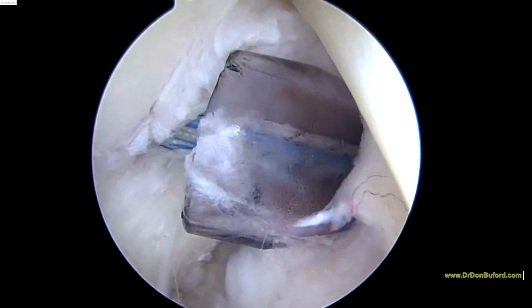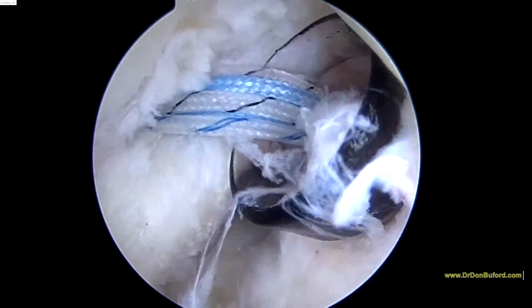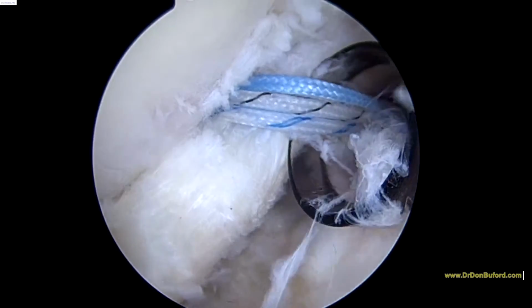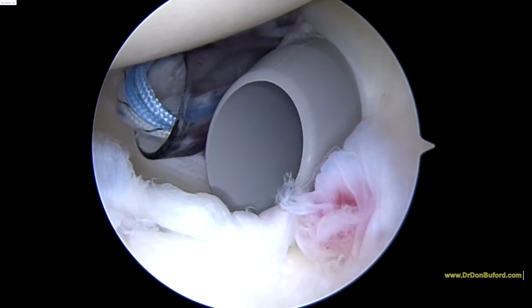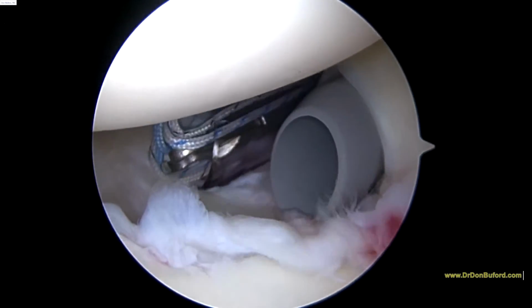Okay, so here are the 3 sutures from the anchor that we just put into the bone here. And now we're going to do some tricks to pass these. We'll show you some more in just a minute. Now we're going to go ahead and start passing our sutures. We'll probably just use 2 of these.